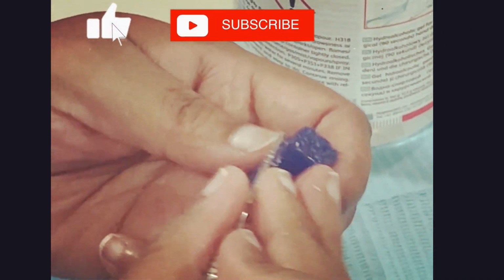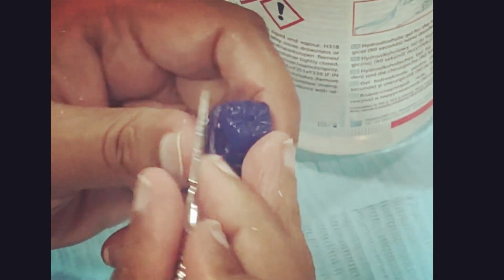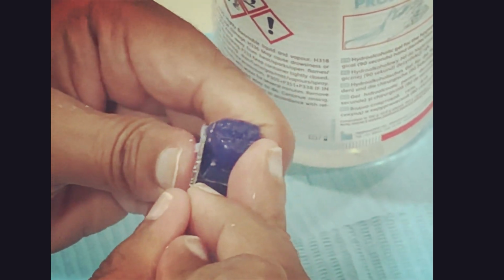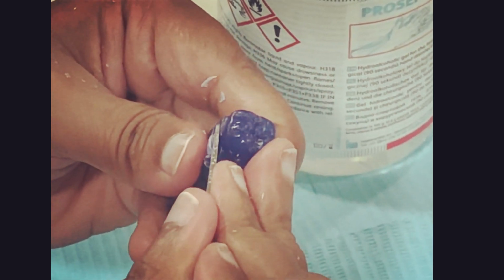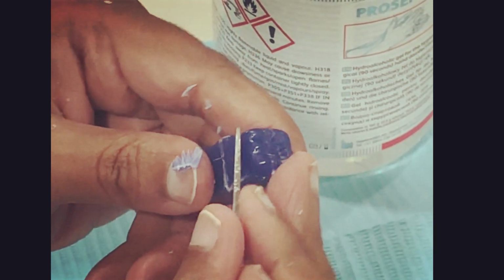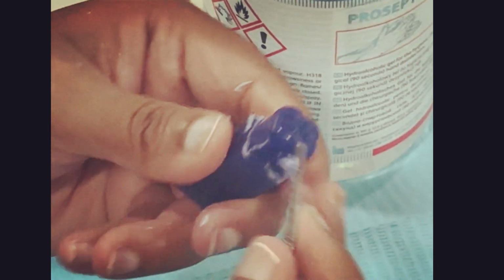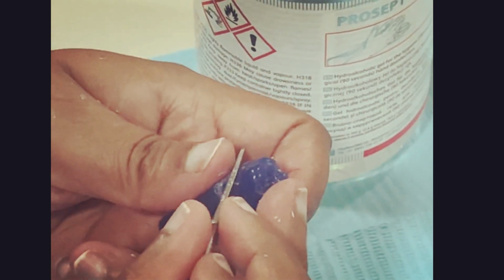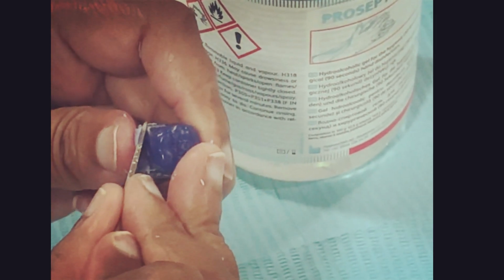Not much to remove because your tooth is almost as big as your wax block, so you just have to remove that small ledge which is there. Okay, first make it box-like, and then you can do the smoothing or rounding.